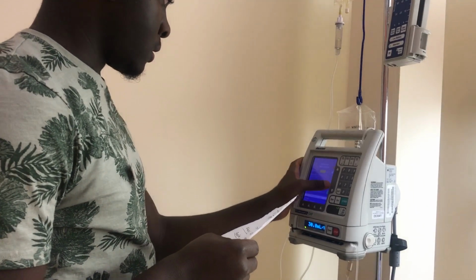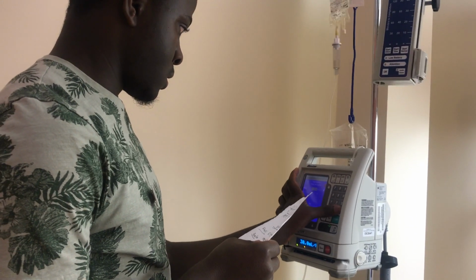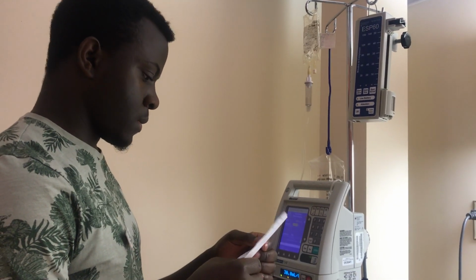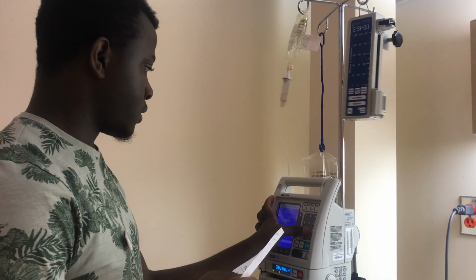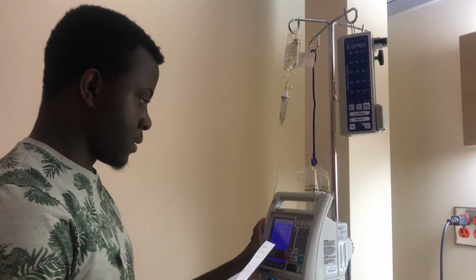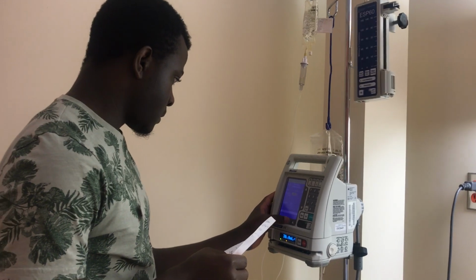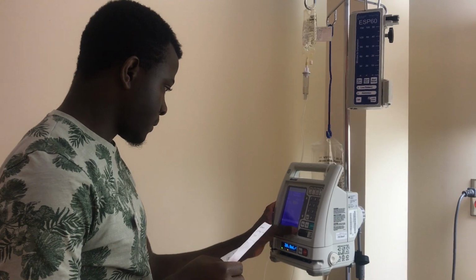I'm here today to give you your hydrocortisone for your inflammation. And so I was wondering if you could tell me your name and your birthday. And I'm going to compare my final volume and my marks. My final volume is 51.2, and I'm going to complete my first check. So the patient is on the right side, as we said. Hydrocortisone is the medication. The dose is 150 milligrams. The route is IV. And the time is now at 3 o'clock, every 4 hours.